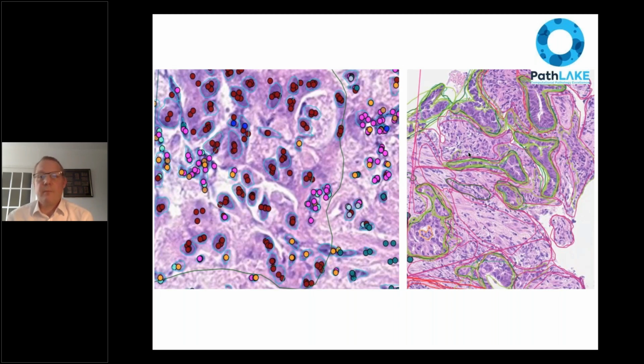And likewise, when it comes to measuring regions of interest on the right-hand side, in this case, obviously areas of invasive carcinoma and desmoplastic stroma between the tumour islands, it's interesting to see what levels of agreement there are between pathologists. Quite good, of course, between the areas of where the tumour actually is and where it ends. Less good about where desmoplastic stroma begins and ends. That's a much more difficult judgment call to make and leads to greater variation. So it gives us an understanding of how difficult it can be sometimes to provide this ground truth data that our computer scientists would want us to.